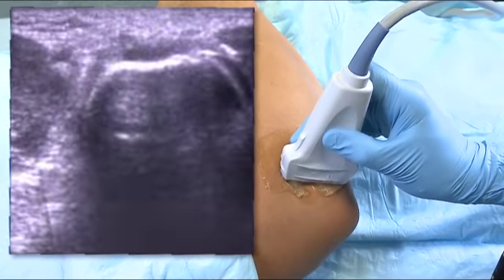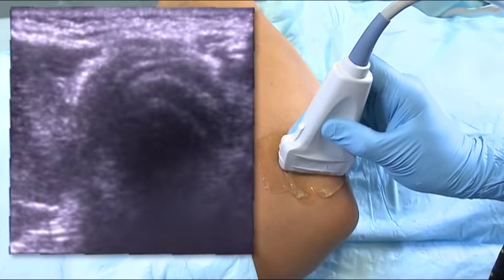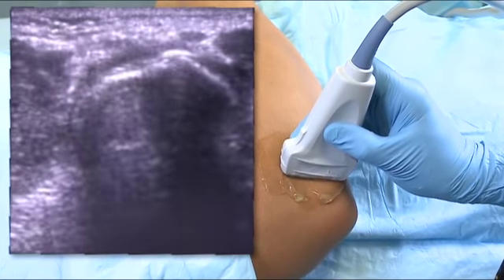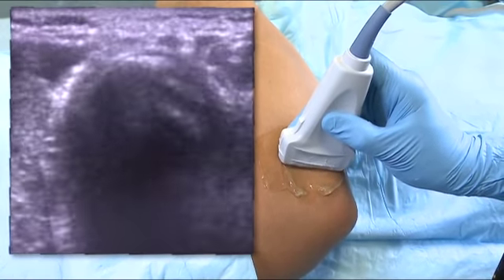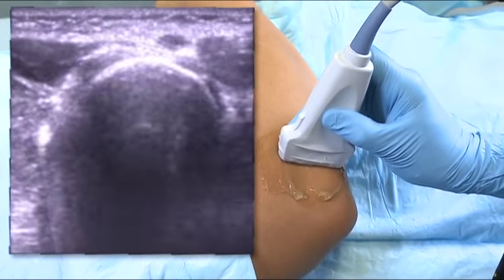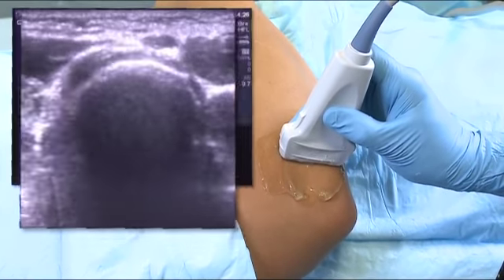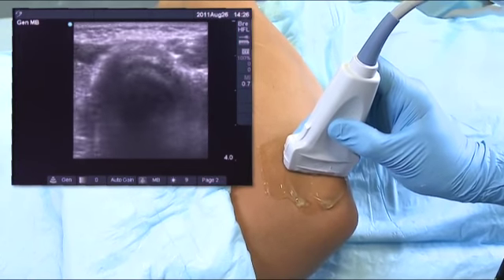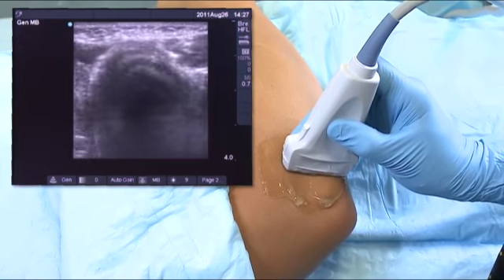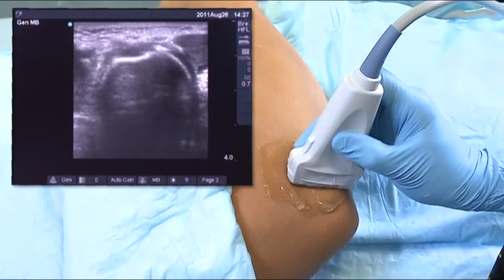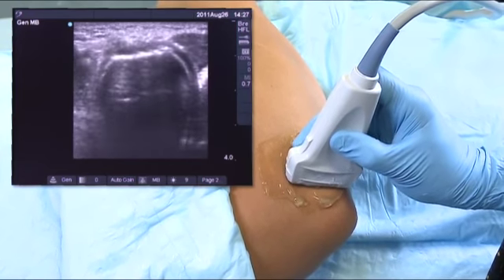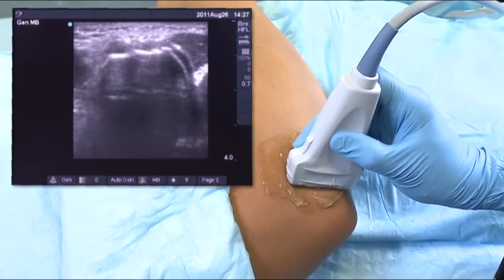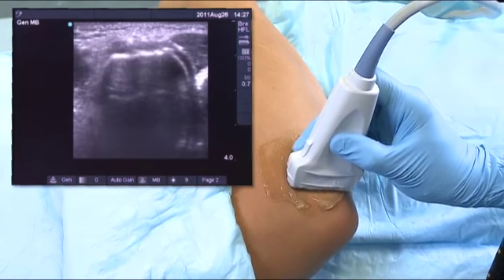As I progress through the joint space moving distally, you lose the image of the epicondyle. Here you're in the joint space making the transition between the capitellum of the epicondyle, and then the radial head appears as a very hyperechoic bright region. So on a transverse view you have the radial head, the joint space with no bony landmarks, the epicondyle, and then above the epicondyle where the tendon is inserting, you have the dark regions indicative of disease and damaged tendon tissue.